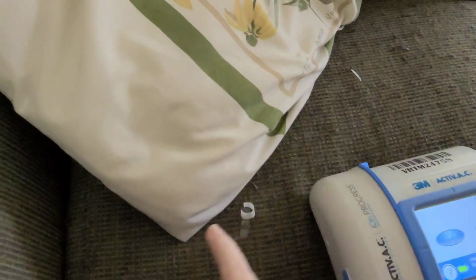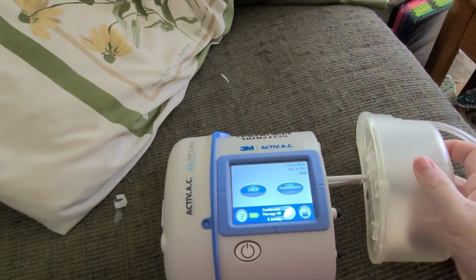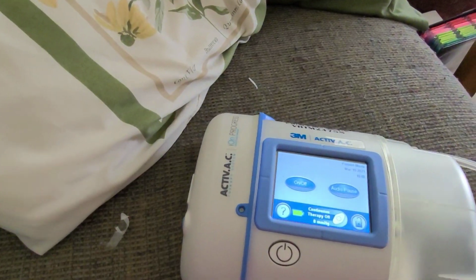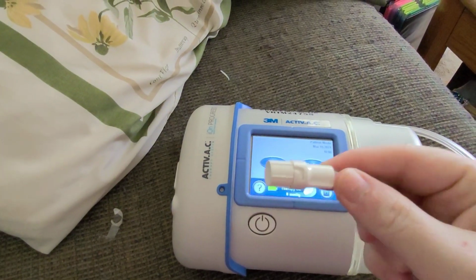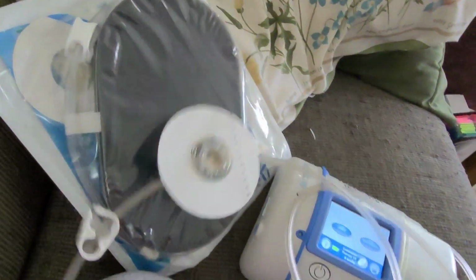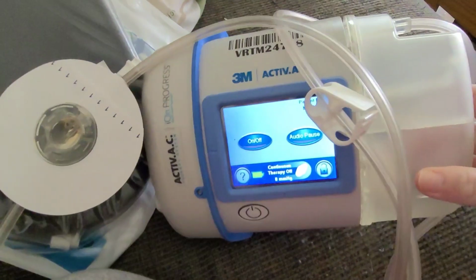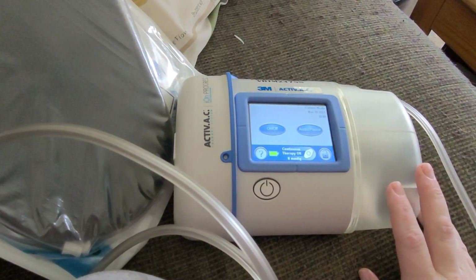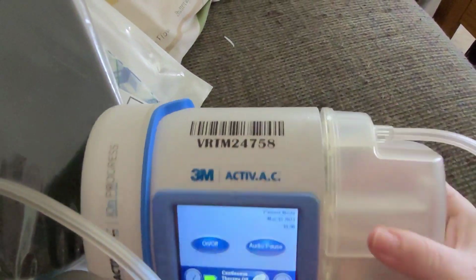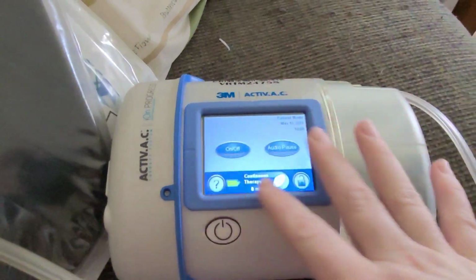Okay, so get rid of the garbage. This piece hooks into right here, like this, and just like that. Then this piece right here will hook up to the other piece I was just showing you that is connected to the wound, and everything gets sucked into this canister right here. They do have a bag that I put this in because the kids and everybody are really sensitive about it, saying it's gross, which I don't blame them.